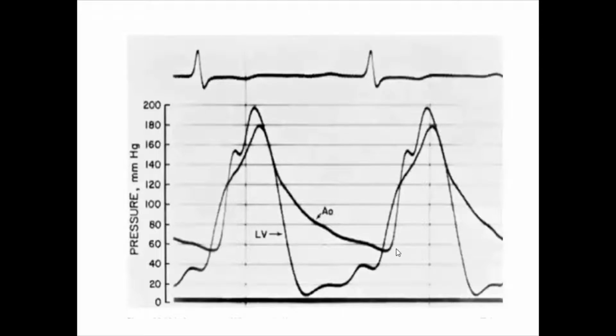So you said aortic regurgitation. Why did you say aortic regurgitation? There is a diastolic gradient between the LV and aorta. A diastolic gradient between LV and aorta is a normal finding, because the LV pressure is around 120 over 10 and the aortic pressure is around 120 over 80.